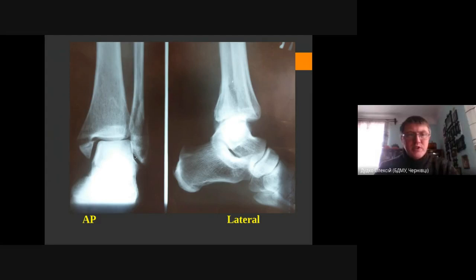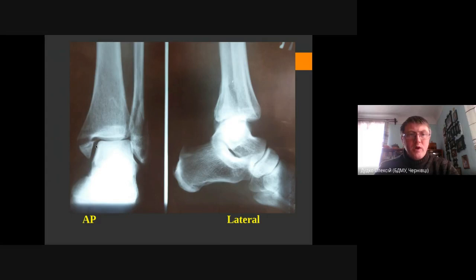The next thing we should check is the position of the talus bone. We are checking the medial space, the lateral clear space, and the so-called Shenton's circle. We check the length of the fibula as well.